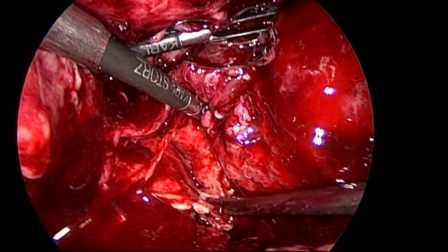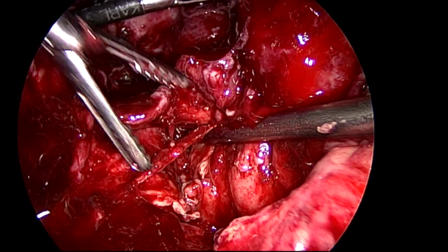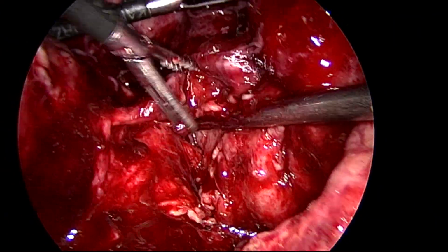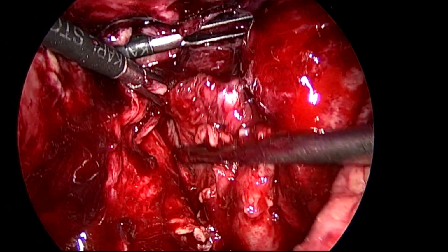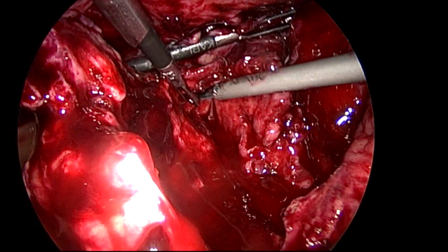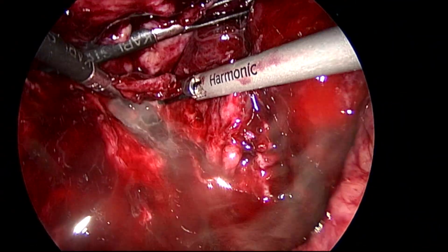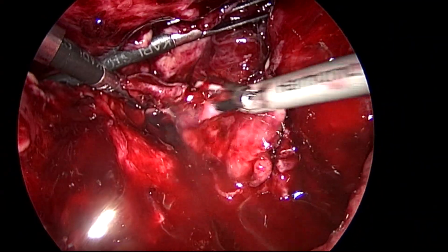Empyema is one of the difficult types compared with the gangrenous type, because dense adhesions will be there to the surrounding structures. So, I am not able to separate with the suction nozzle, I am using a harmonic scalpel. That may be the perforated site, it is densely adherent.